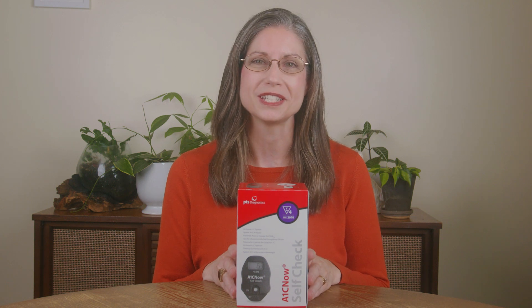Hi there! Thanks for purchasing your A1C Now self-check test kit. Today I'm going to walk you through the steps of how to perform your A1C test with your four-count kit.